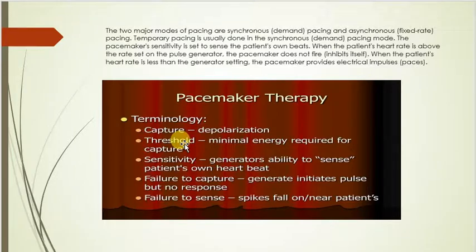And then you have a mode called asynchronous, where there's a fixed rate, and that means that it's going to pace no matter what the patient's heart's doing. So temporary pacing is usually done in synchronous demand pacing mode, unless the patient requires asynchronous, where they're not making any attempt to have a heart rate or not. So like if you had somebody with any of our heart blocks, especially third degree AV block, you do want the beats that are coming through to come through. And so it's going to be demand pacing.